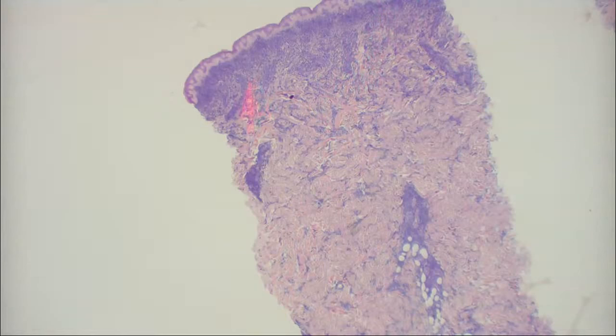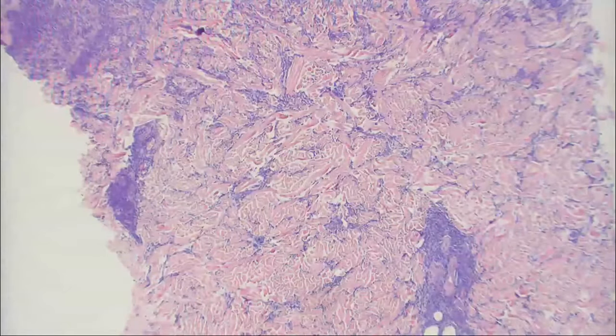Mm-hmm. And is the epidermis involved? No. And there's a Grenz zone. There's a Grenz zone. Good. And notice you've got this almost diffuse infiltrate at the top. And then what kind of pattern do we have down here? It's kind of like interstitial. Yes, interstitial. Good. So we've got an interstitial mostly pattern down here with probably the same thing. It's just that there are so many cells they finally form this nodular, more diffuse appearance superficially.